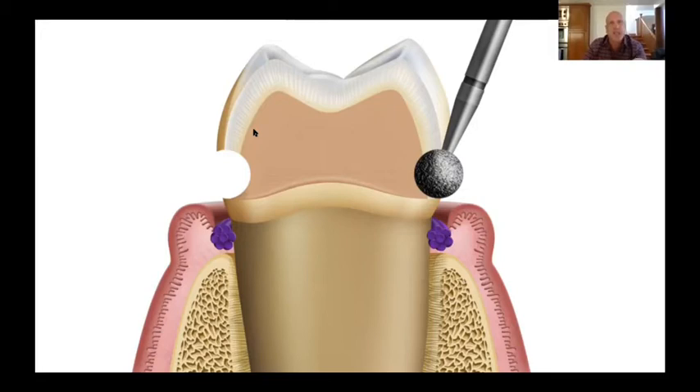The depth of that margin is just determined by how wide the diameter of that round burr is. In cases where you can't fit the round burr interproximally on the mesial and distal, don't worry — that's still connected by that 56 burr we did in there. We're still going to go in and smooth up the gingival margin. This is how you get nearly perfect margins every time. There's no easier way to prep a margin. I've tried everything to get a great margin — I found nothing easier than using this round burr and using it early in the technique.